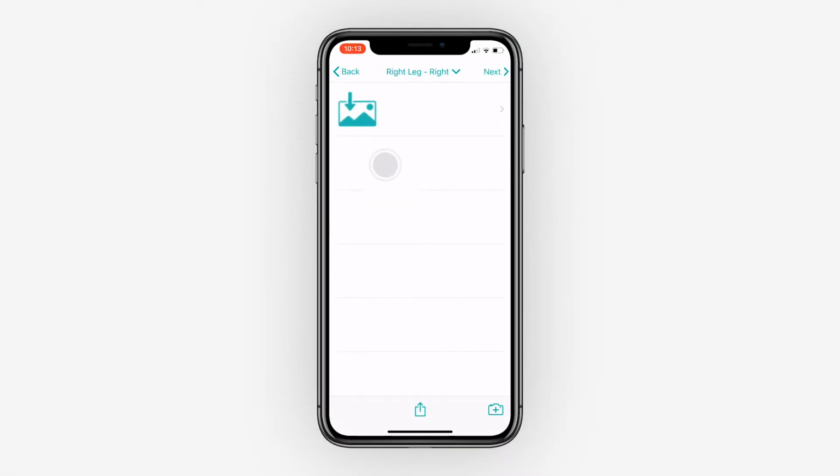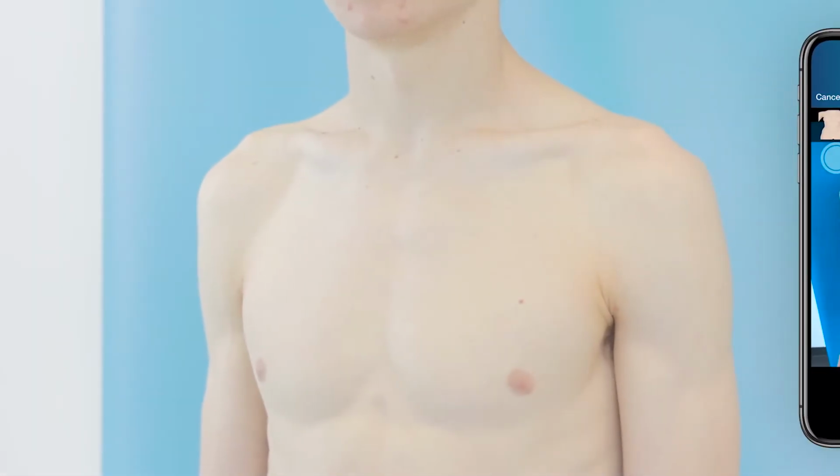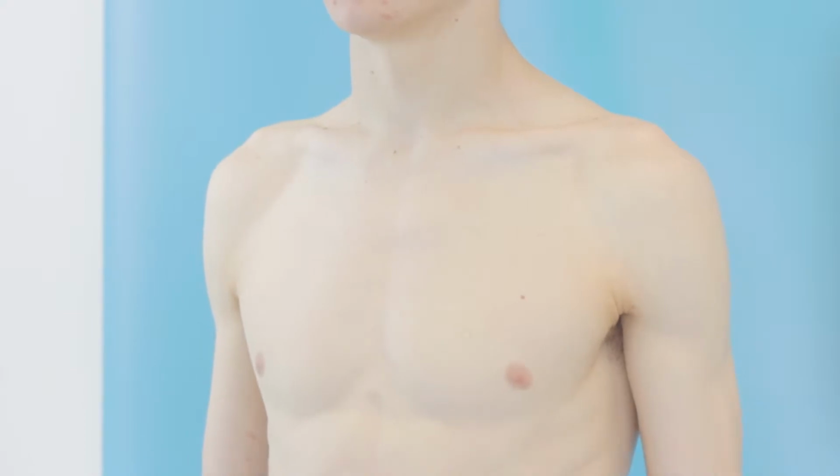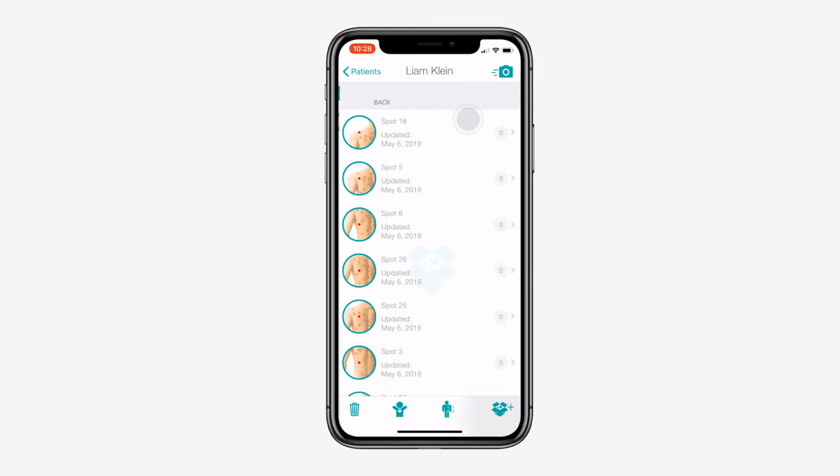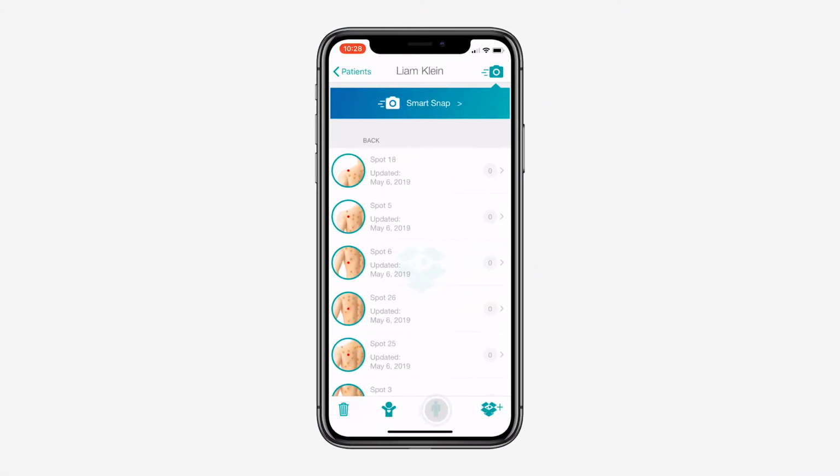It is extremely important that the image acquisition is done correctly. For high-quality images, maintain a distraction-free and consistent background in a well-lit space. For serial images, you will now be able to use the Ghost template to help obtain comparable images.